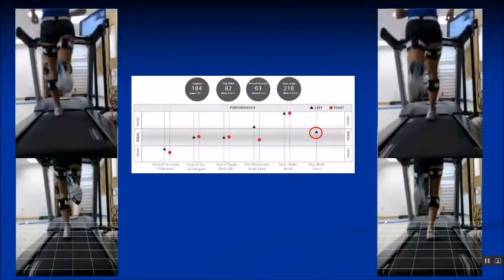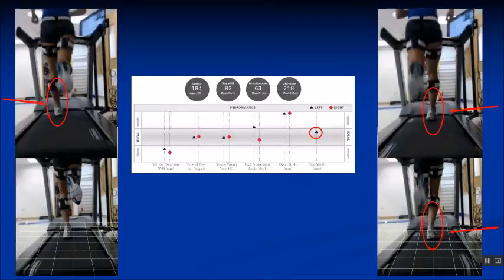When we look at step width, from the video there was an appearance that she may have a crossover gait, but the system records the width at the first foot strike. Looking at the top view, on the left we have a heel strike and on the right a forefoot strike, and at this point there is a normal width. However, overlaying a grid showing the position of the right foot once fully loaded gives the appearance of crossover gait, when in fact this foot position is due to what's happening at the hip and the pelvis.